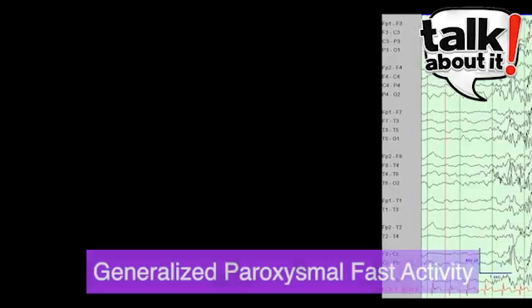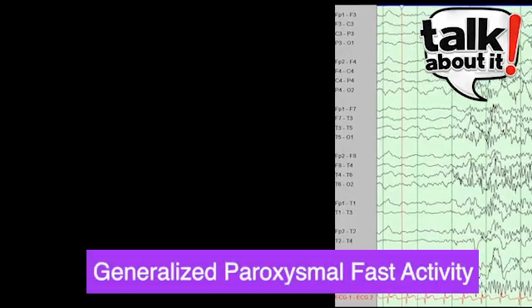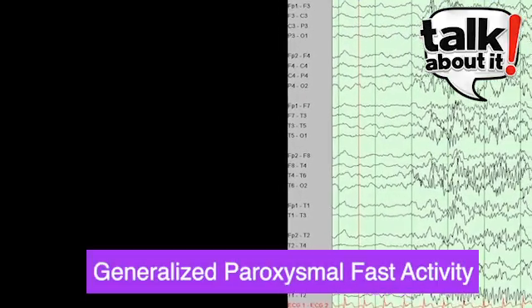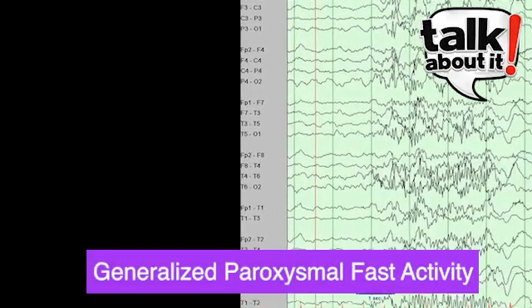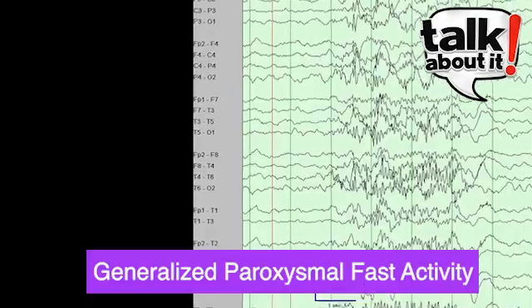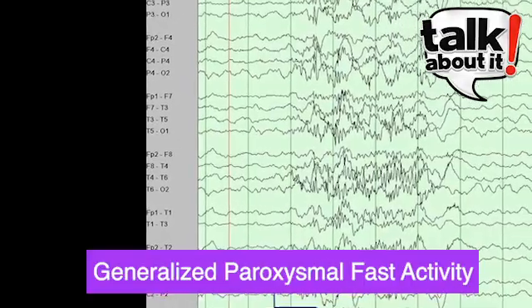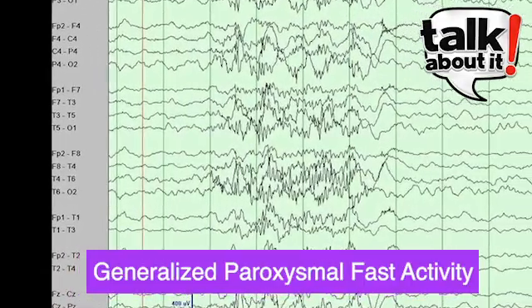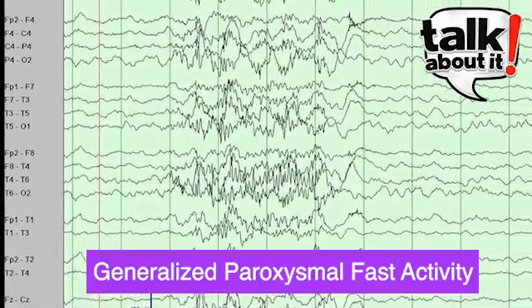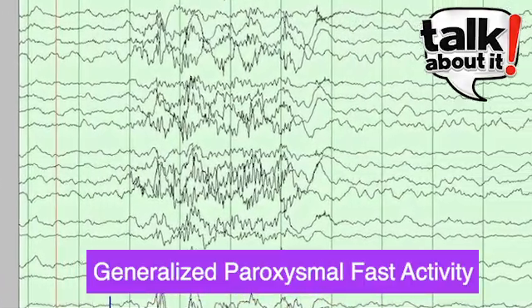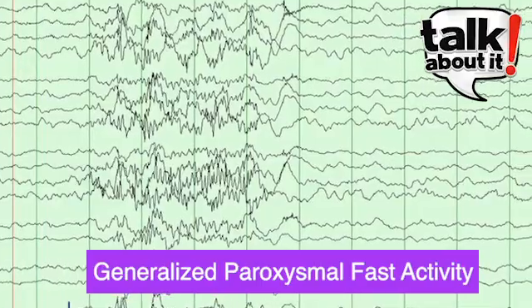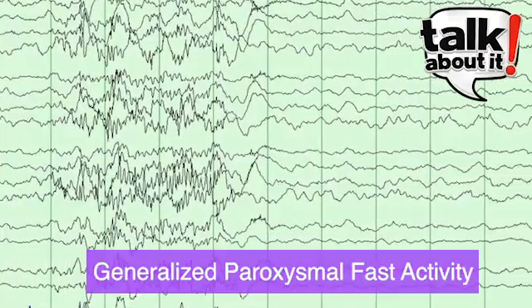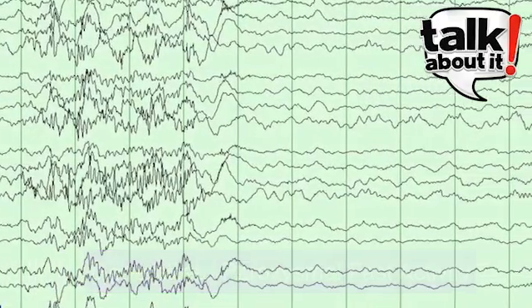Generalized paroxysmal fast frequency is another pattern commonly seen in LGS, and a pattern that can actually often persist into adulthood. That's where the EEG flattens for a brief moment with a very fast frequency on top of it.